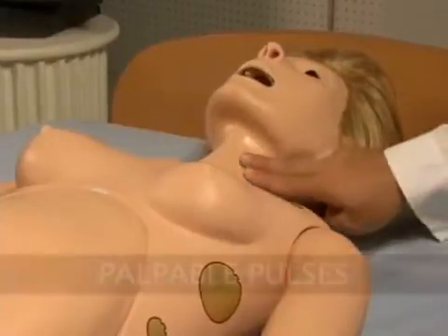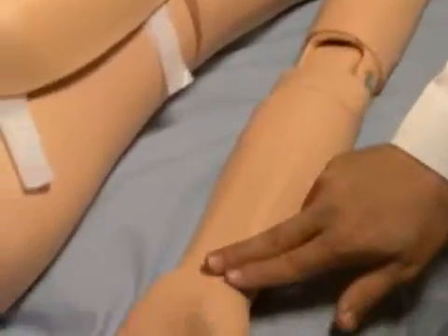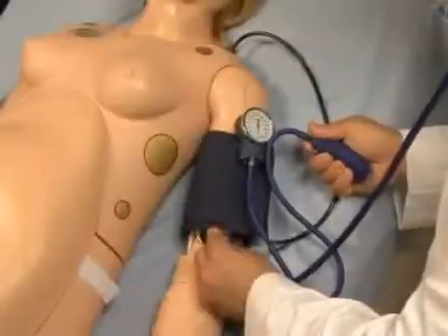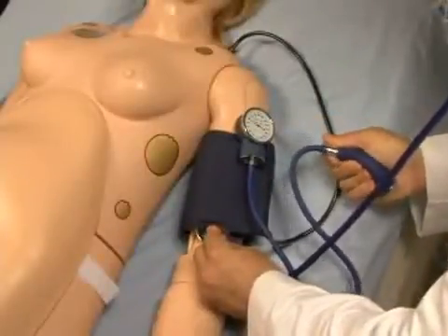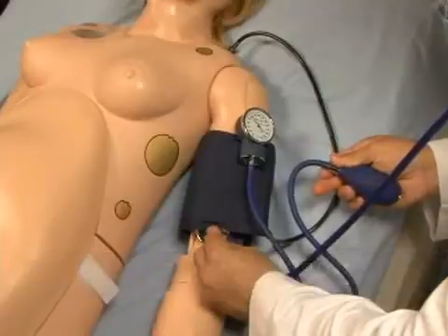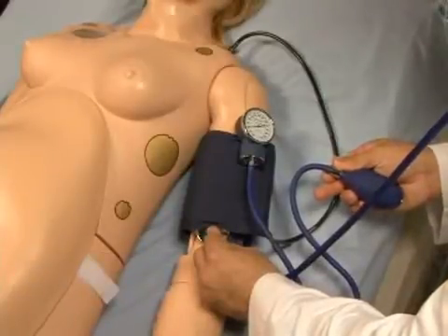NOEL's palpable pulses are dependent on blood pressure. Users can also disable distal pulses to simulate severe hypotension. Programmable blood pressure can be read using a sphygmomanometer, and users can auscultate the Korotkoff sounds.